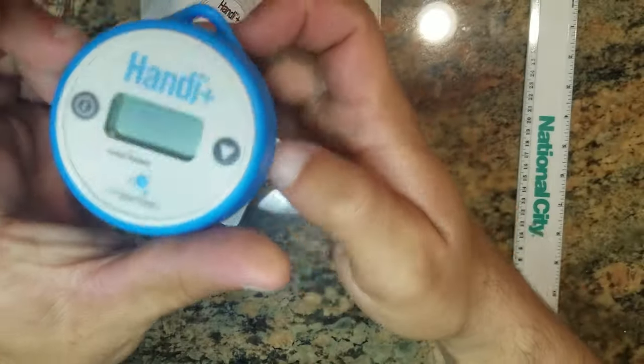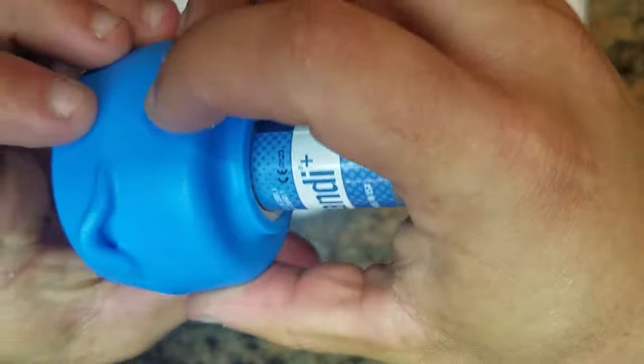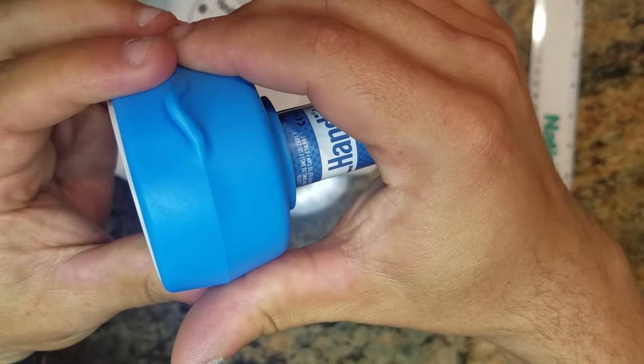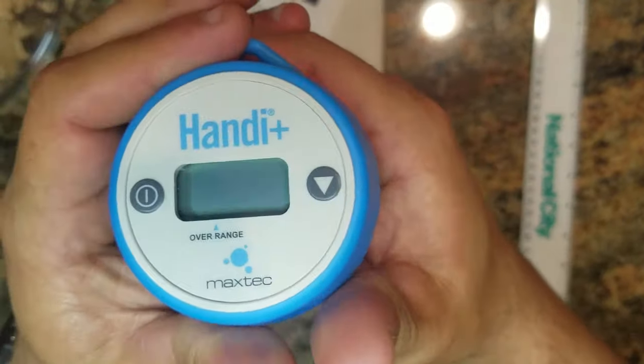This is the display. It's wrapped in a rubberized coating, which makes it a little more durable — for example, if you drop it.